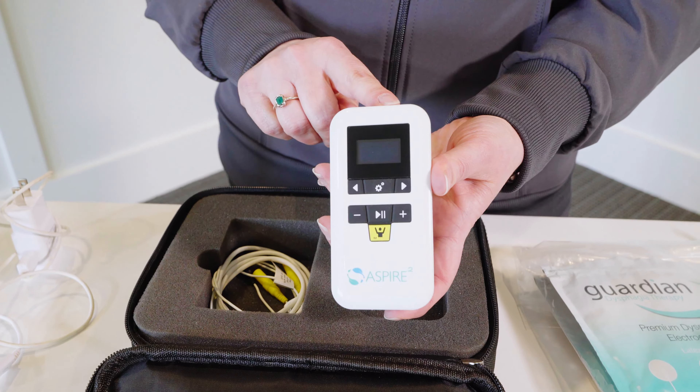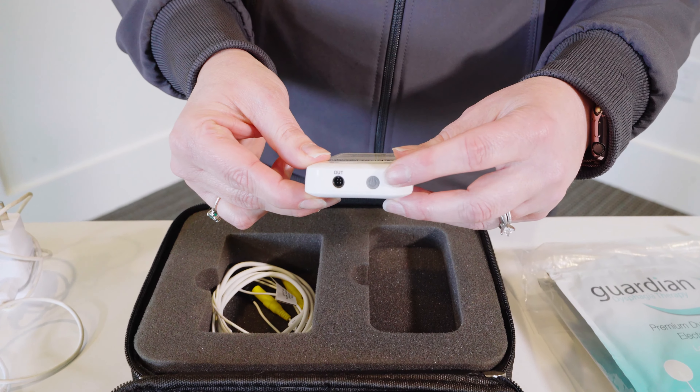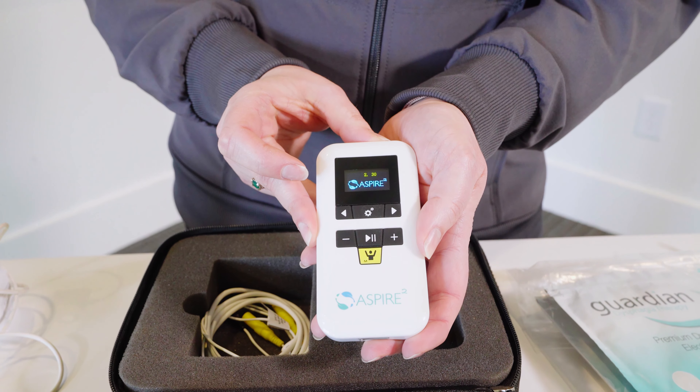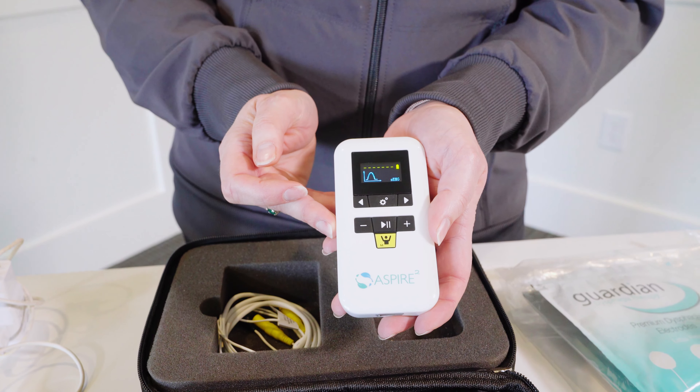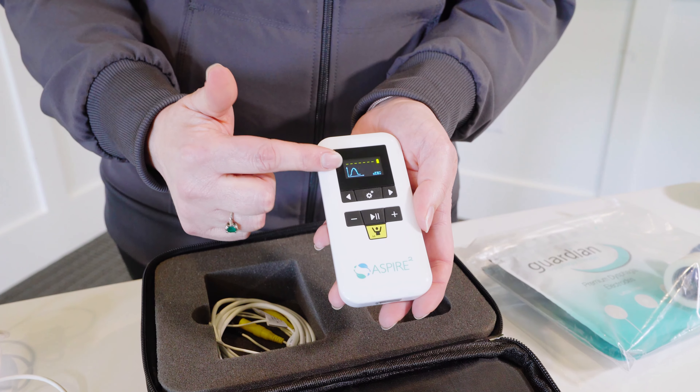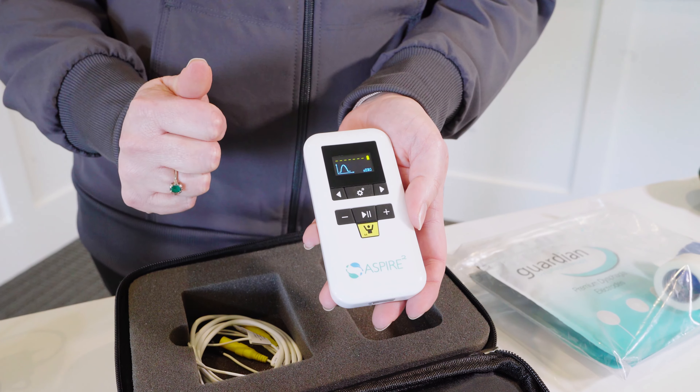Let's go ahead and power it on. You'll notice a gray power button on the top and you'll just need to hold it down for a couple of seconds until the screen comes on. The device starts out in surface EMG mode and that's what we'll cover first today.